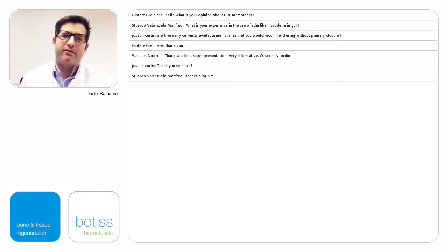This is not enough for a large graft with a bovine or a non-bovine bone substitute material. So using a membrane will support soft tissue healing. There's still some doubt whether we can support hard tissue healing by the liquid or by mixing it with the PRF membrane. But there's no doubt that the barrier function of a PRF membrane is not comparable to an original collagen membrane.